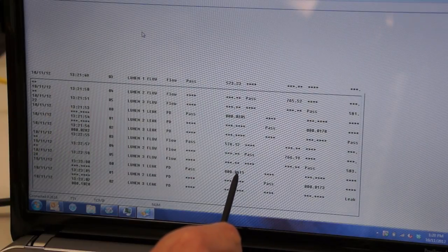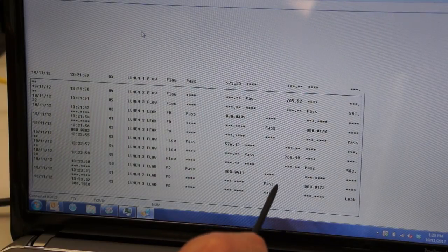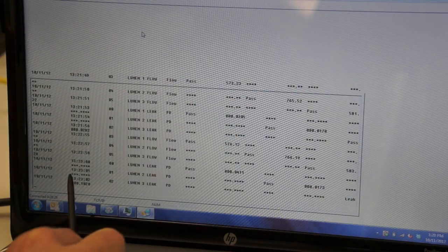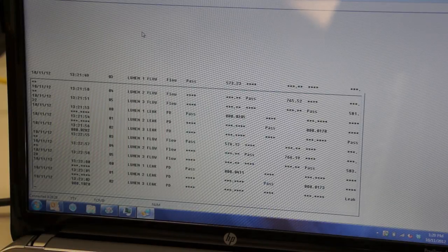Then we had a 0.0411 leak on lumen 1, 0.0173 leak on lumen 2, and we did get a leak failure on lumen 3 with a 0.102 decay. That is at 5 cc per minute.